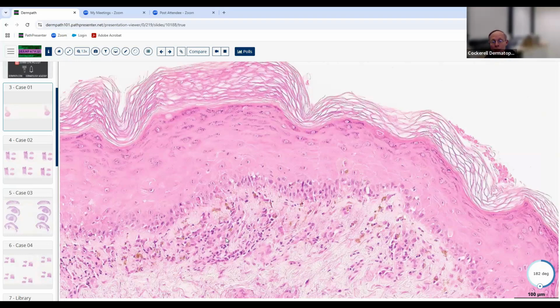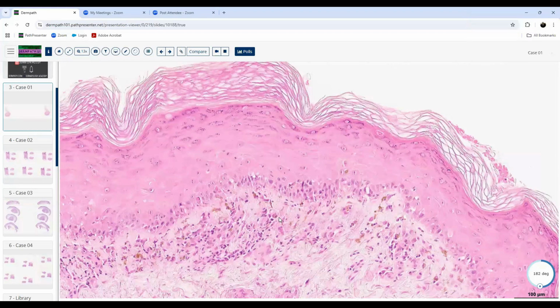If this were a later stage lesion of EM, you'd expect more confluent epidermal necrosis, and we just have these individually necrotic keratinocytes at the junction, with the effacement of the rete ridges, and then you've got the melanophages. So this is probably fairly chronic. In other words, this probably didn't happen just yesterday.